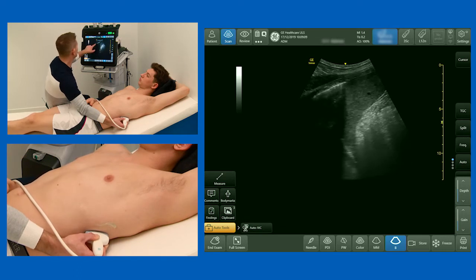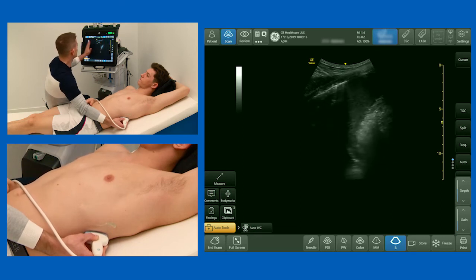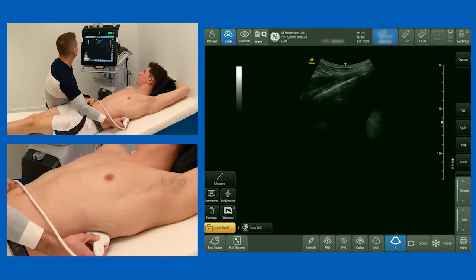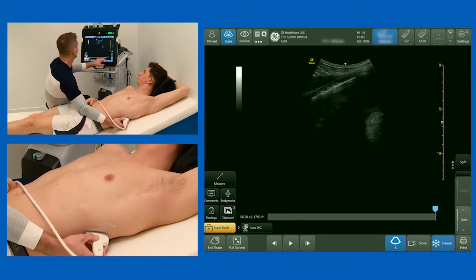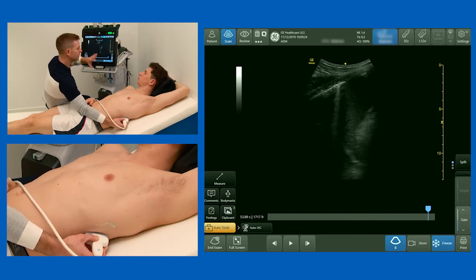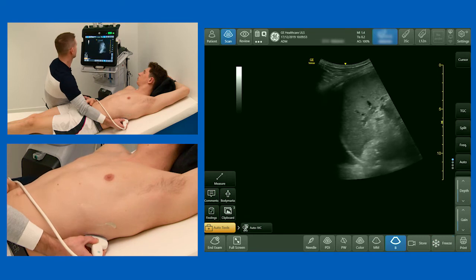As soon as there's pathology — pleural effusion, consolidation, atelectasis — sound waves will pass through whatever's there and you'll be able to see everything in really nice detail. We can still see pleural sliding here. As the model breathes in and out, you can see the lung coming across the screen, sometimes described like a curtain coming across. We also just saw what looks like a B-line — it looks like a comet tail coming down from the pleural line. One or two is completely normal, but if there are lots of them, it suggests the lung is wet or inflamed.